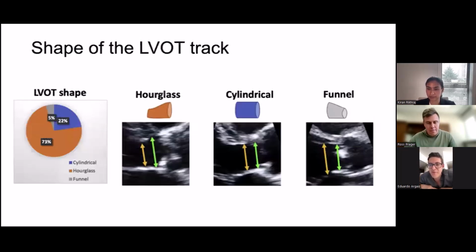And because of the severe sepsis and the hyperdynamic state, this sigmoid septum was causing obstruction of the left ventricular outflow tract. And of course, when you do a VTI with pulse wave Doppler, and you have obstruction, you have very turbulent flow, and we've discussed this in our podcast with Katie Whisker.